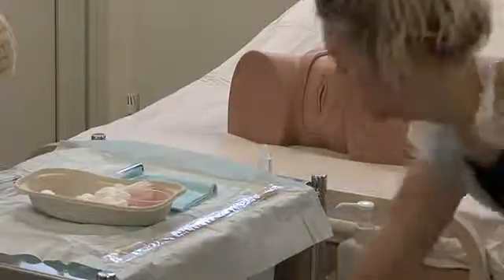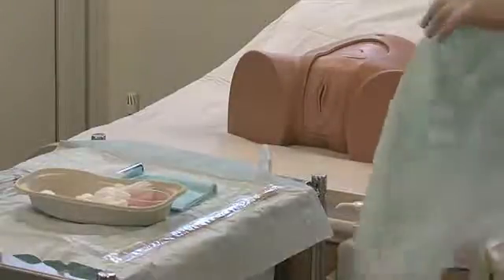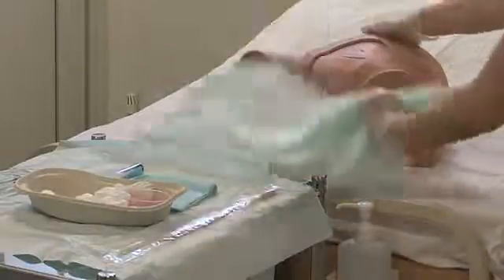The patient should be positioned supine with knees bent, hips flexed and feet resting about 60 centimetres apart. There is no need to fully expose the patient at this stage. Place a disposable incontinence pad under the patient's thighs.